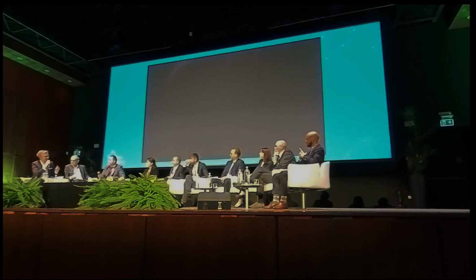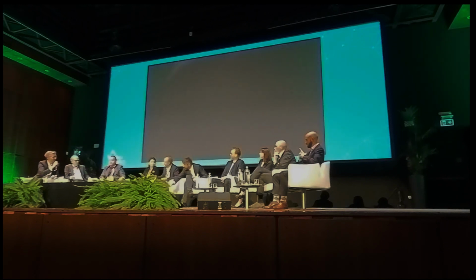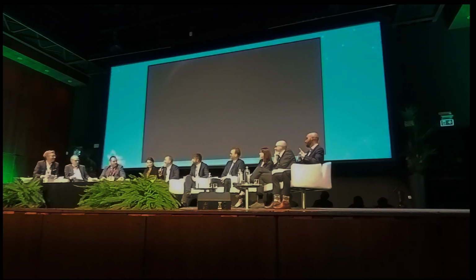Okay. Thank you. The very last question to you, Andres. Would this be an unmet need for you? Like a real need for this? Can I be honest? Of course you can. It depends on Dr. Egg.